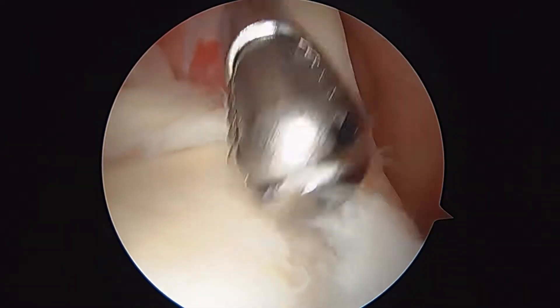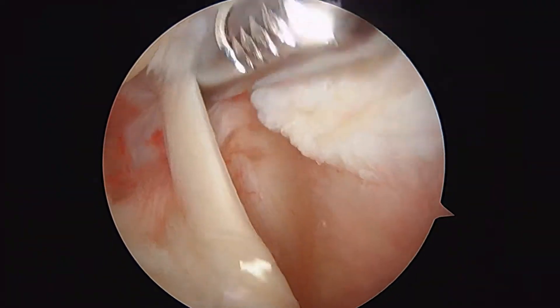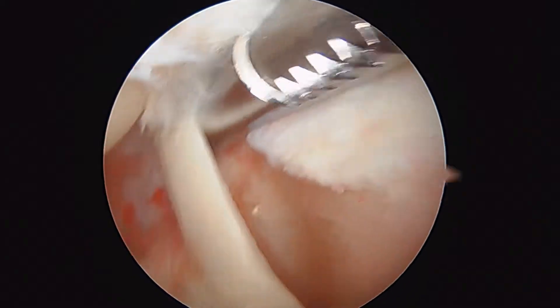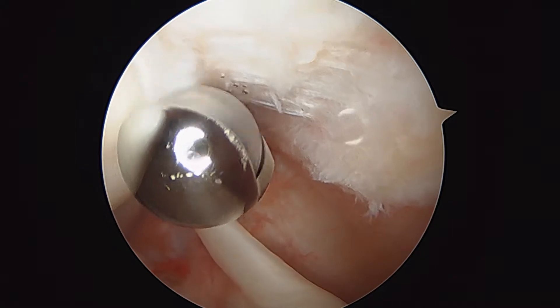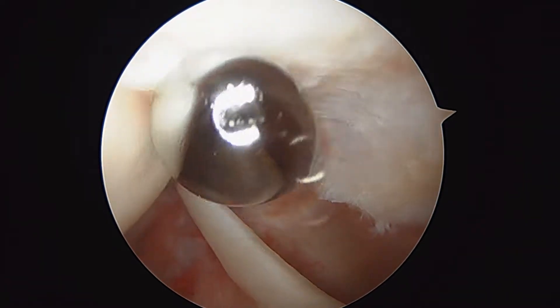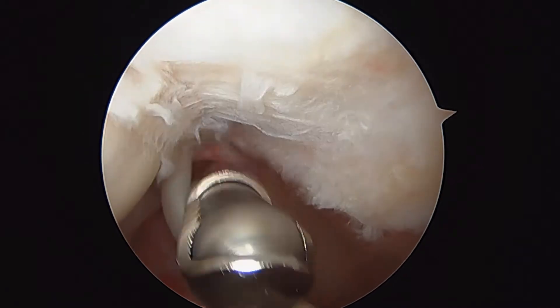I'm a little bit suspicious about this biceps. I'm concerned because the rotator cuff tear, at least at this point, doesn't appear to be full thickness on this side. A lot of times we'll see this, and on the other side of the tendon it's got a significant partial tear also. So it ends up being the same thing as being completely torn.